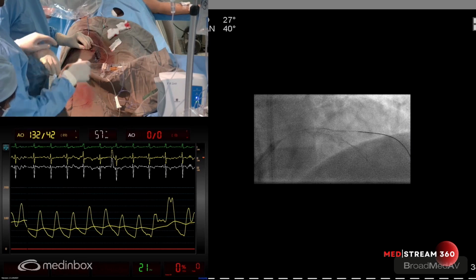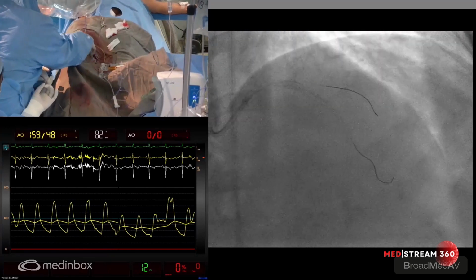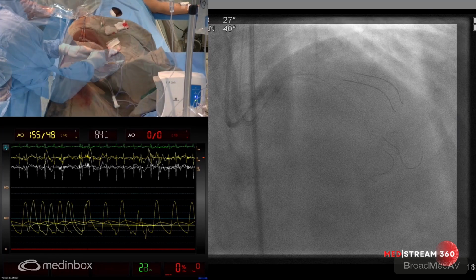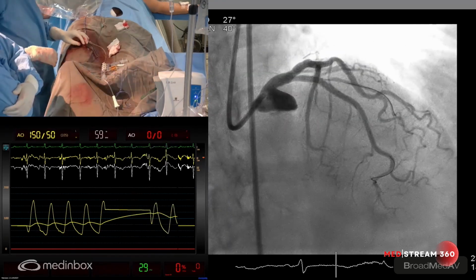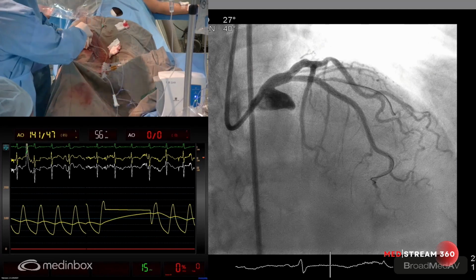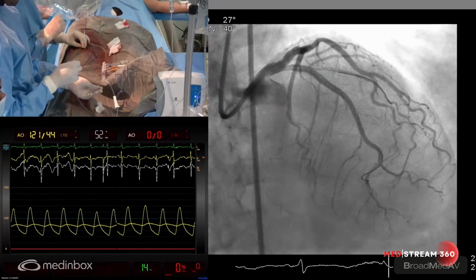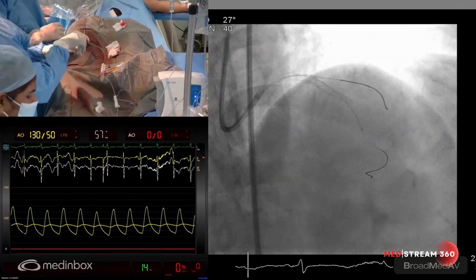Okay, now we'll quickly do an IVUS and have a look after a small angiogram. So just to be sure we shall give some nitroglycerine and then take a shot, to see if we have created any dissection or anything of that sort. Some nitroglycerine, please. Okay, ready for a shot? Okay, so it looks pretty good after the high pressure of 3.5 at the proximal juncture. The diagonal is still flowing. There's not much of any ECG changes. IVUS, please. So let us go with the imaging and then decide whether we require any more high pressure dilatation at the proximal juncture. Okay, let's wait 5 more minutes.